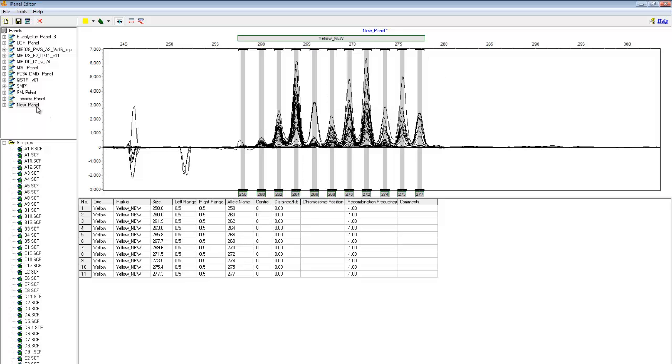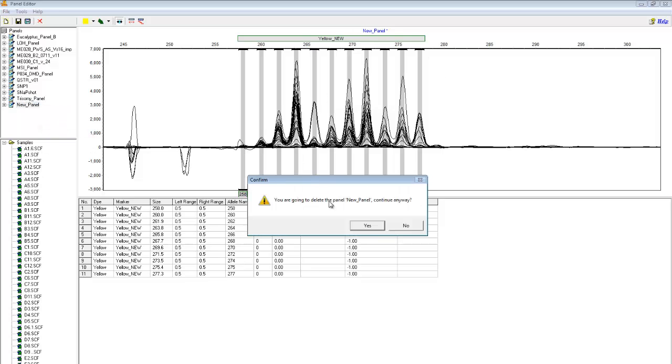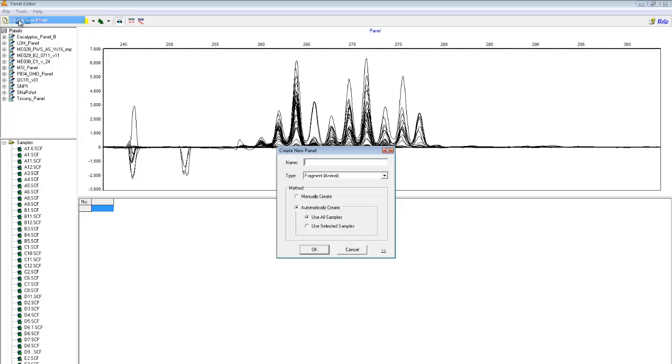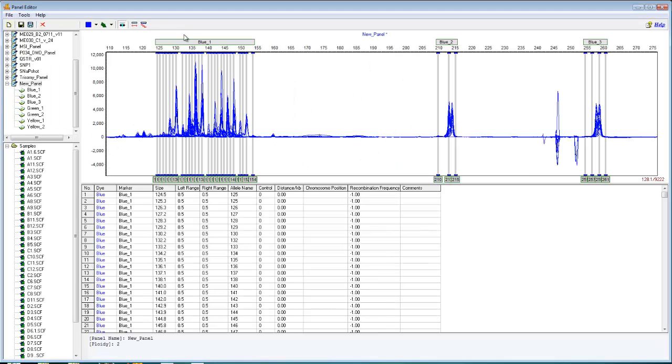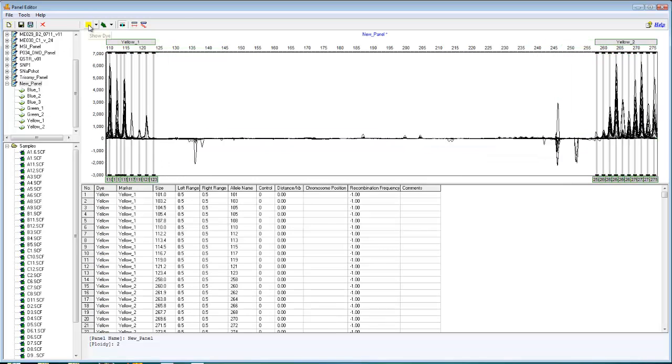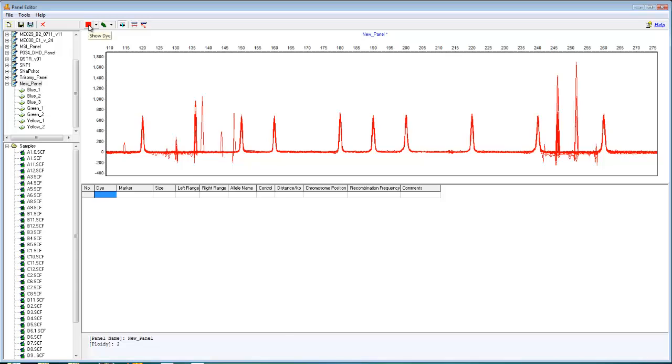I'm now going to delete this panel and recreate it using the automatic create option. I'll rename it new panel. I have automatically create selected, and I will use all samples.